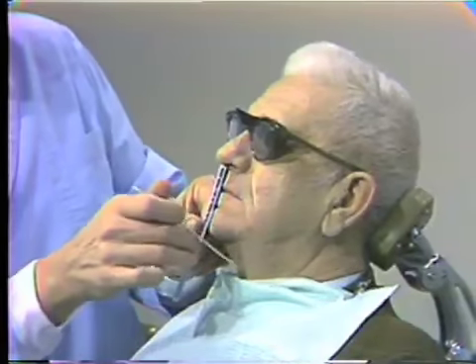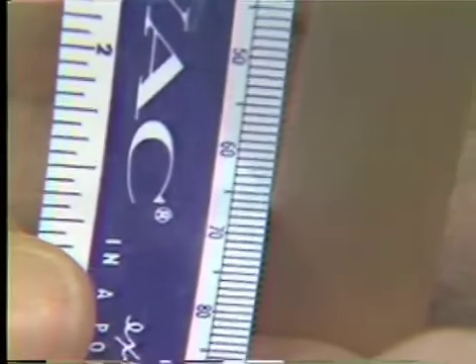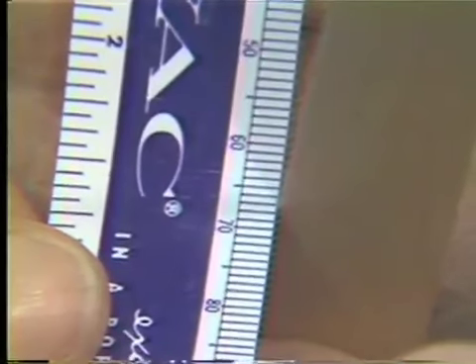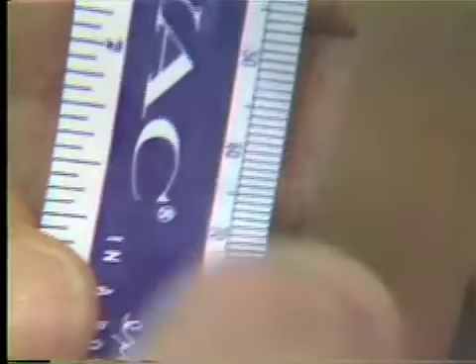We're going to go back and double check this again. As I said, this is a subjective type of evaluation. We constantly review it to make sure that we are where we want to be. So again, we'll use our millimeter rule. Now, Mr. Monahan, you have those rims tight together, don't you? All right, fine. And the measurement that I'm reading here each time is 66 millimeters, just what we had predetermined to be our vertical dimension of occlusion.